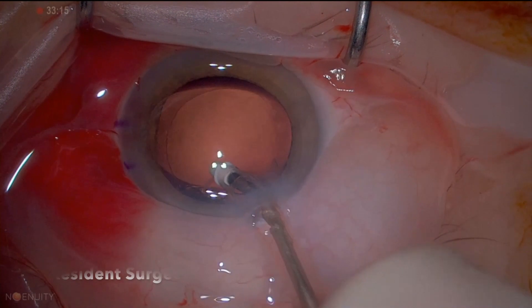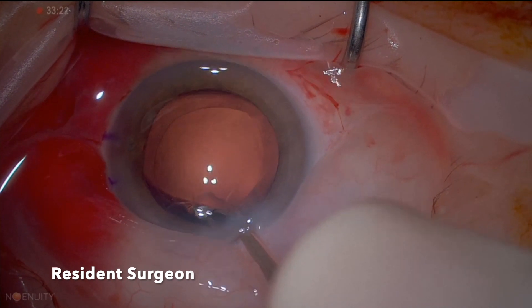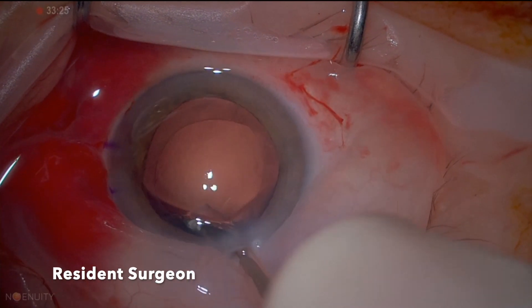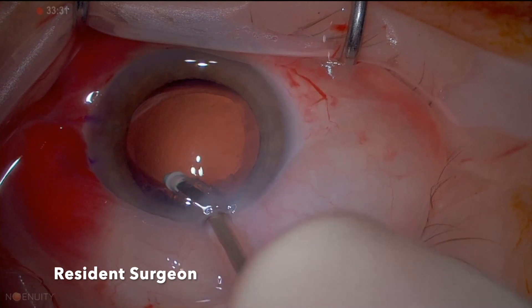This case is operated initially by a resident. The resident did very well, finishing most of the cortex, now working on the sub-incisional cortex. There's a problem, mainly because of not engaging the cortical lens matter well and specifically not engaging them from the anterior aspect.